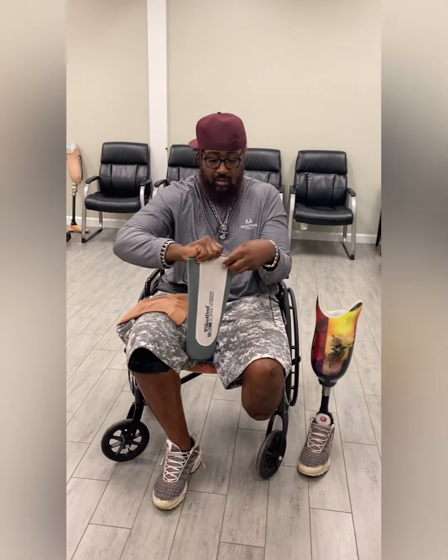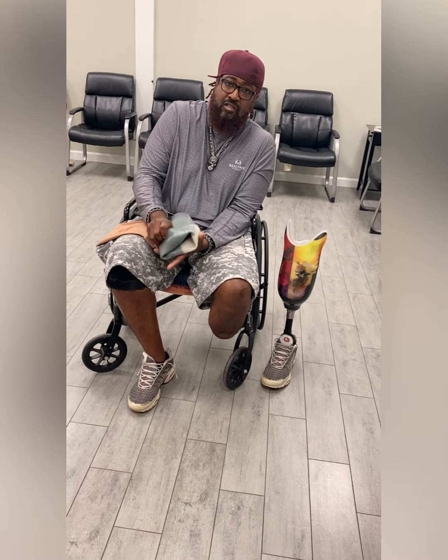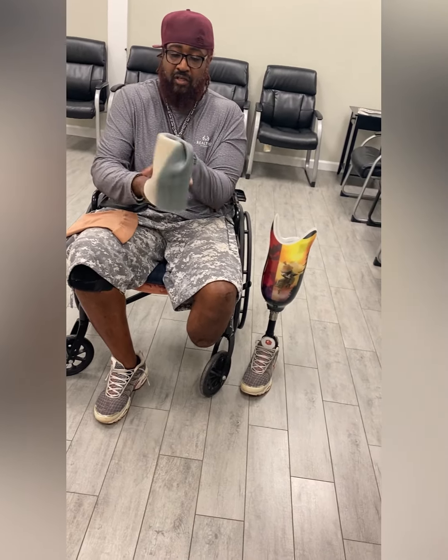In this video we will be going over how to don a below the knee pin system prosthesis. Start by reflecting your liner inside out. Remember, if your liner does have a front, get the proper orientation of the liner when you put it on your limb.